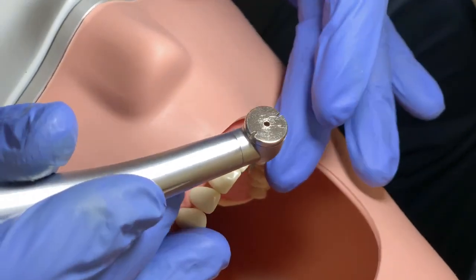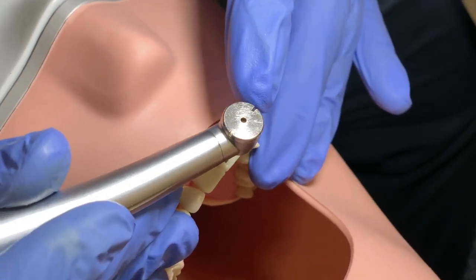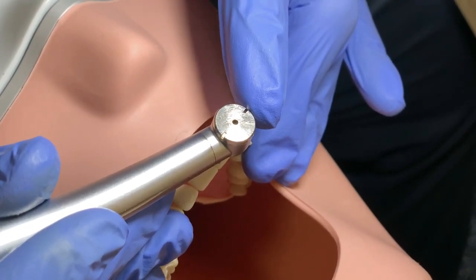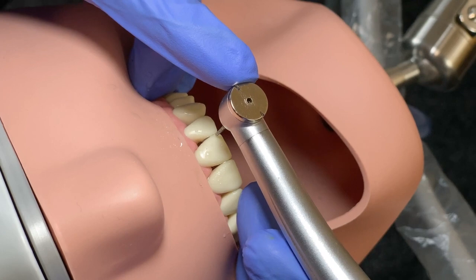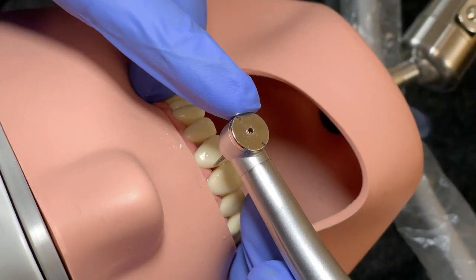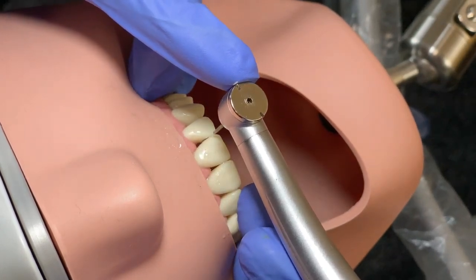Let's start now. It's very important to have good finger support, and you can use your other index finger to support your handpiece. Now we will do what we discussed earlier. I will try to outline my finishing line — this is a very, very important step. Let's go.